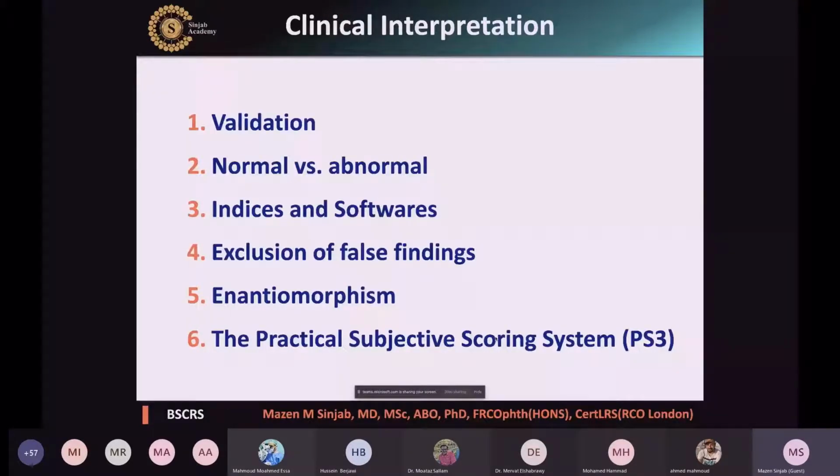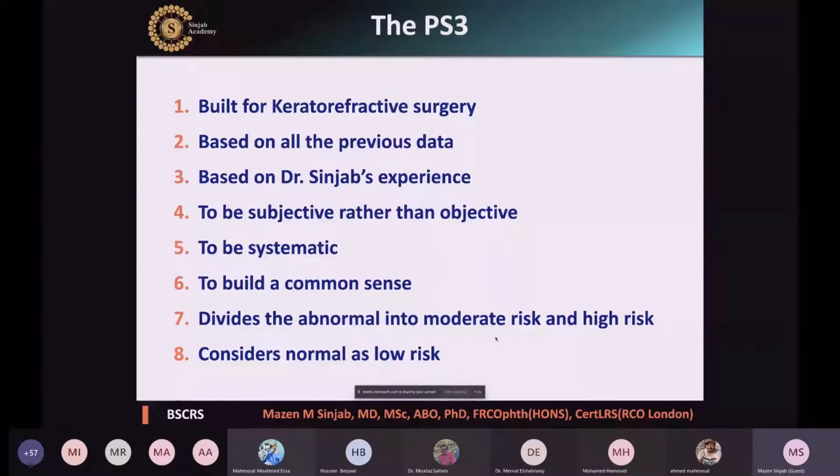Actually, every time I talk about this, many people send me, what is your source? What are your sources? On what did you depend? Okay, great. This is why I intended to show you the references for every previous slide, the references that I depended on. Now, how I put this PS3: it is built for keratorefractive surgery, not for lens-based refractive surgery. It is based on all the previous data and in some aspects on my experience, okay?